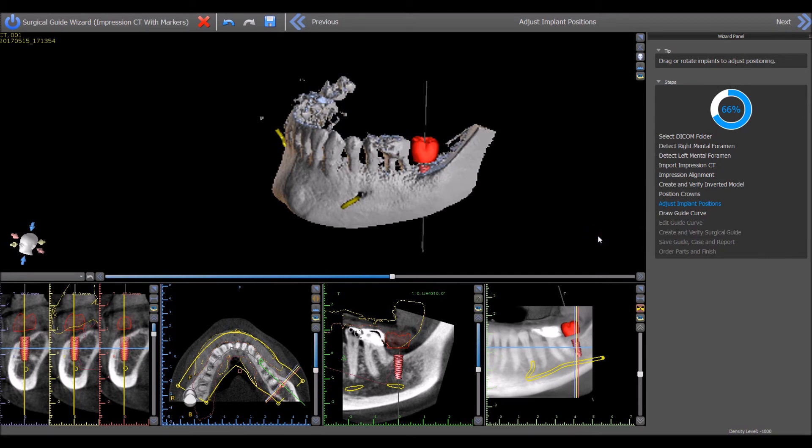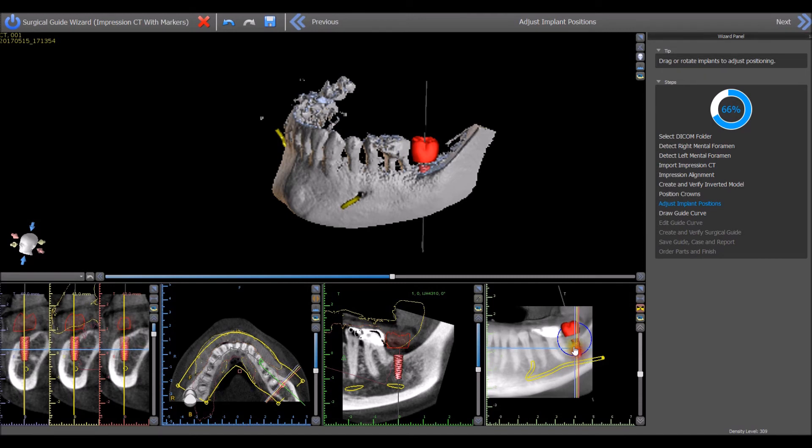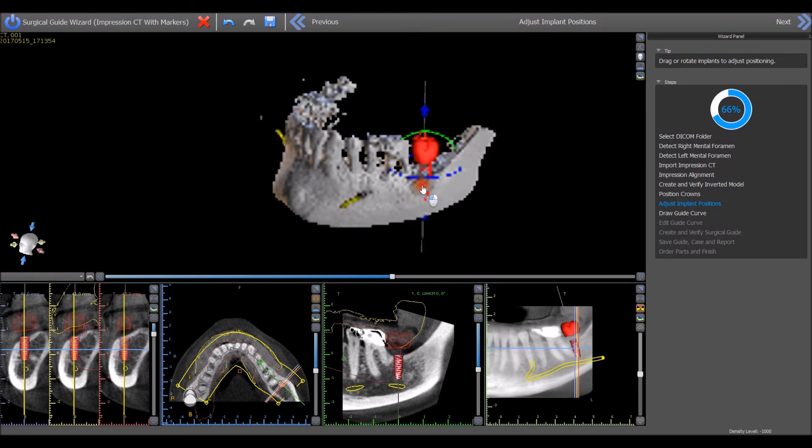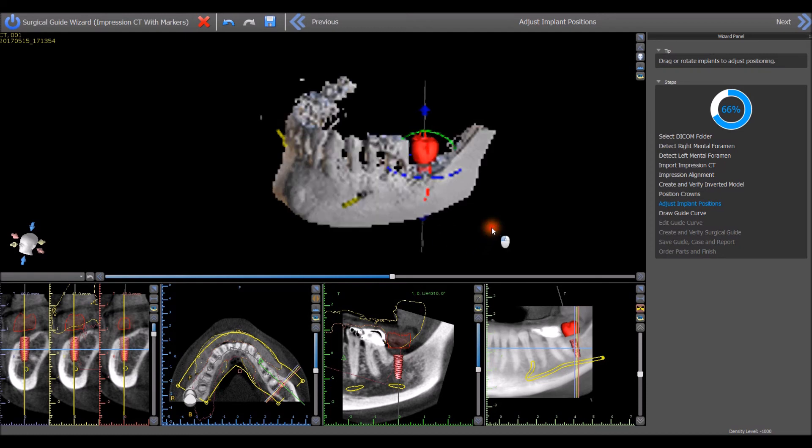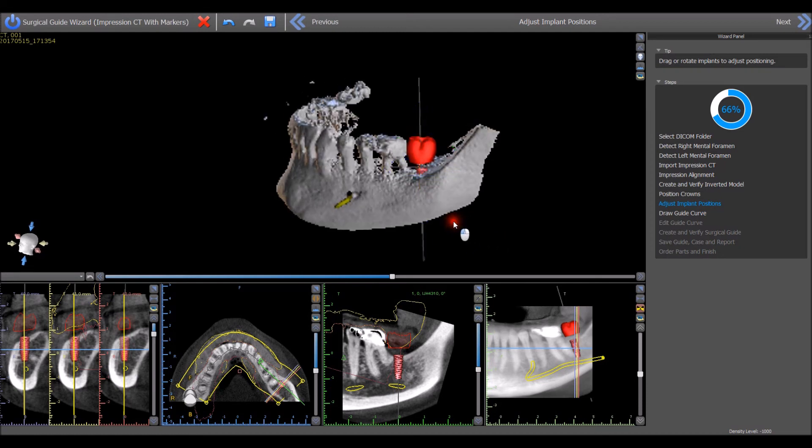Now, in any view, use the left mouse button to move and rotate just the implant without affecting the positioning of the virtual tooth. The keyboard arrows can also be used to nudge the implant placement in small increments. Once the implant is in the desired location, press the Next button.